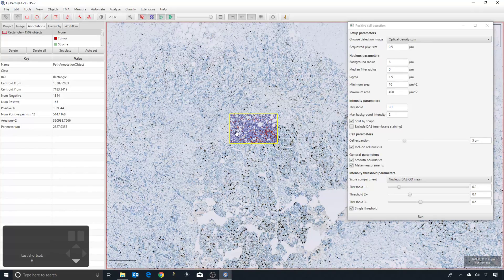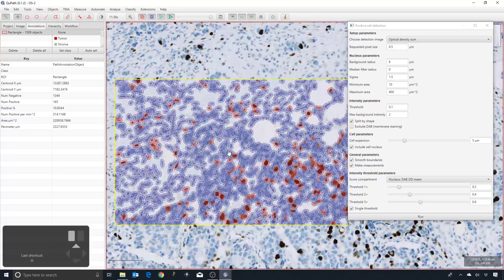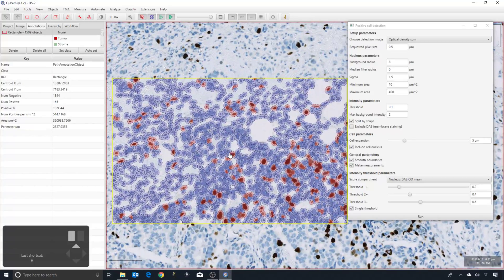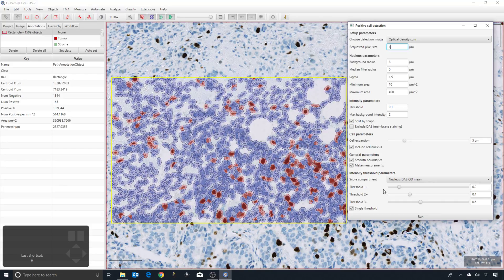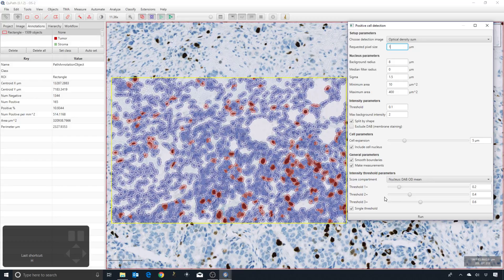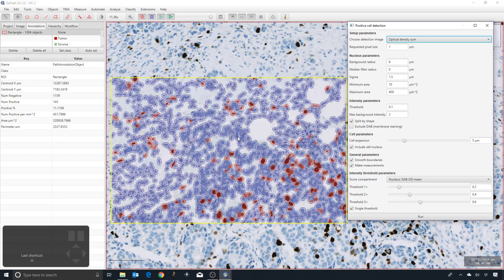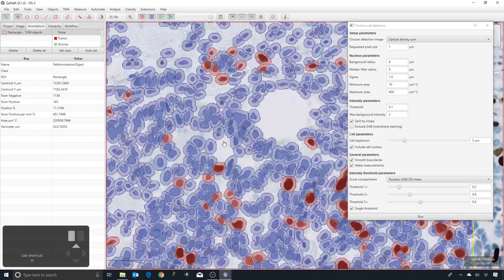You might wonder what happens if you move further, so I'll double this again. Now I'm running on a pixel size of about one micron, so this is downsampled by a factor of four. The detection is much faster. The positive percentage is 11.1%, so again it's still pretty close to how it was before.